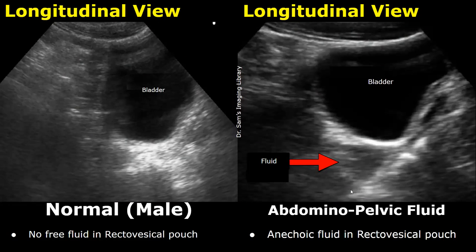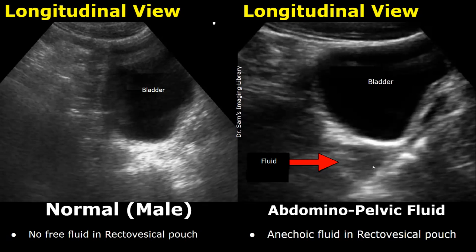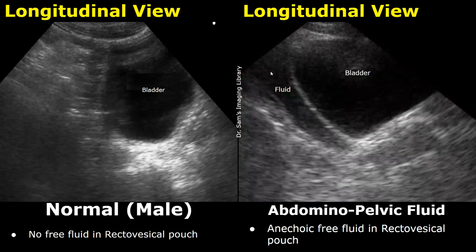This is an image of a male patient. In males, fluid will be seen behind the bladder. In the normal image, no fluid is seen at this location, whereas in a trauma patient, fluid can be found behind the bladder — we can see anechoic fluid with complex areas. Here is another image showing pelvic fluid behind the bladder; this area is known as the recto-vesico pouch.